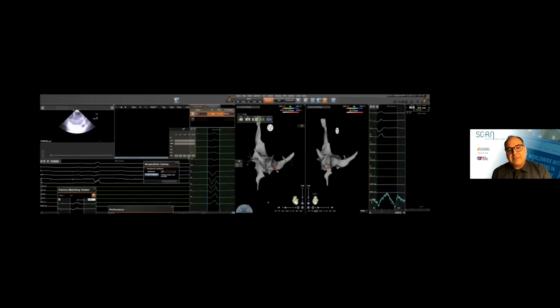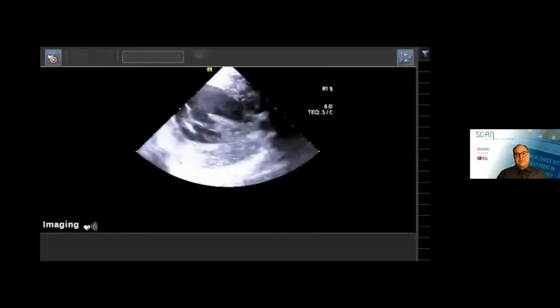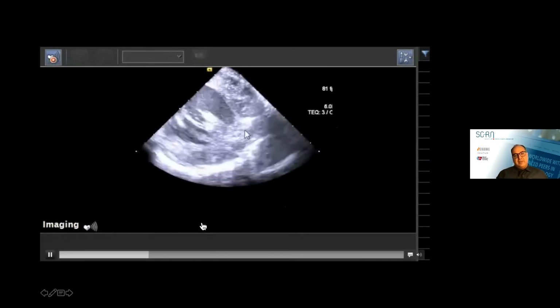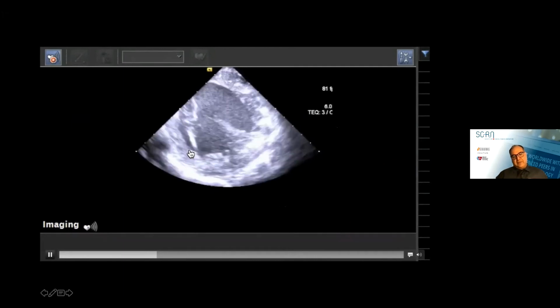I'm going to speed up the image videos at this stage and quickly create an electroanatomic voltage map of the left ventricle. At the same time, obviously, you move the ICE to the RV and start following that. There you go. So it goes into the LV. As you can see, a very good view of the left ventricle. You see the papillary muscle. This is the anteroseptal wall. This is the posterolateral wall. And this is the decapolar catheter coming down here.